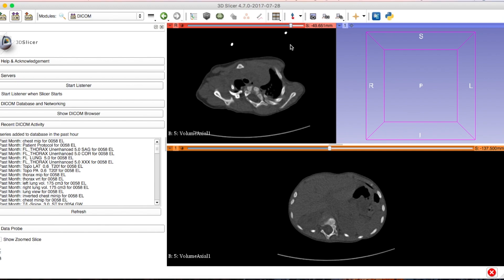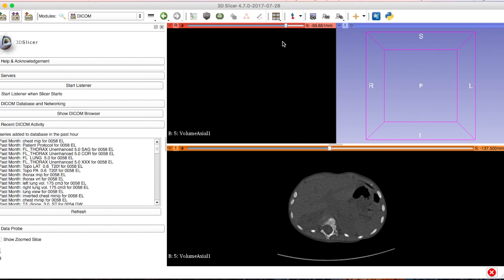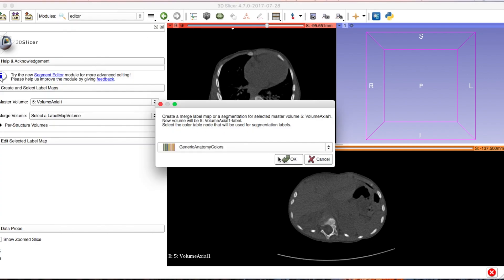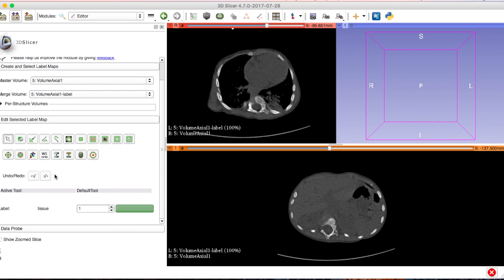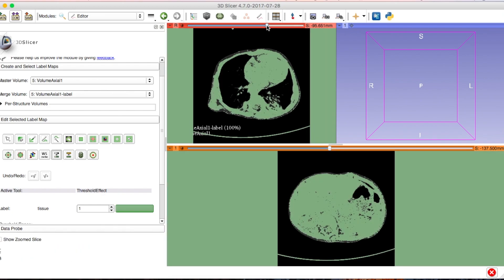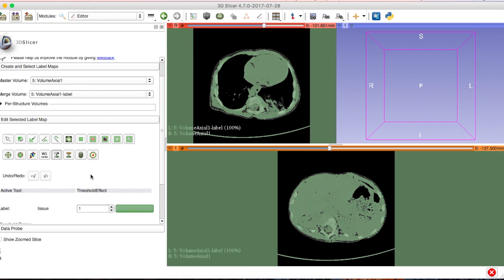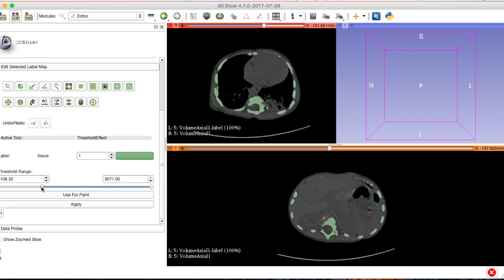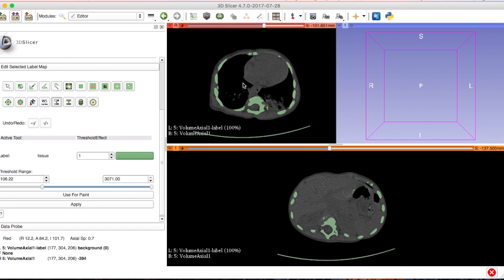The next part is thresholding — I'll explain what that means in a minute. Go to the Editor tool, which is the pen tool in the top bar, or search 'Editor' in the search bar. Click OK and a list of tools pops up on the left. Scroll down a little bit — the thresholding tool is the fourth from the right. Click on that and you'll see almost like a green screen fade in and out, showing what's going to appear on your 3D model.